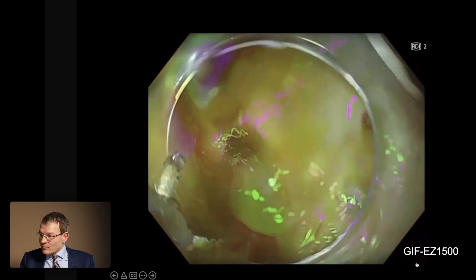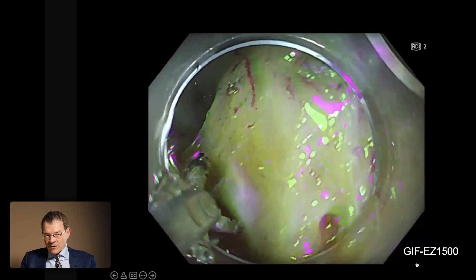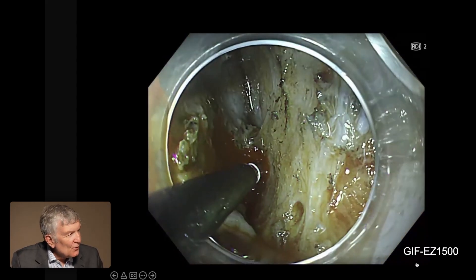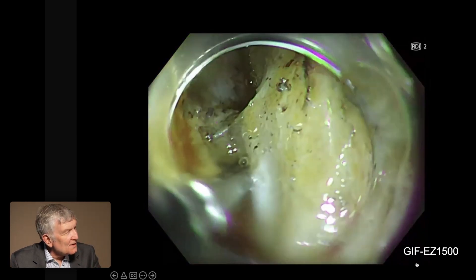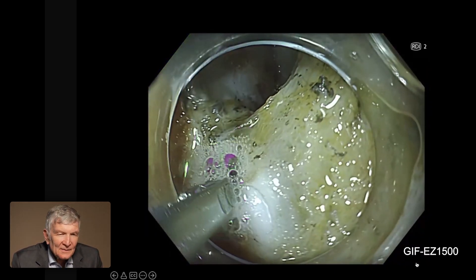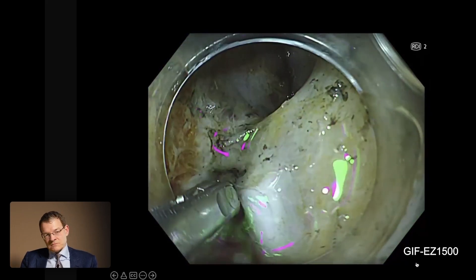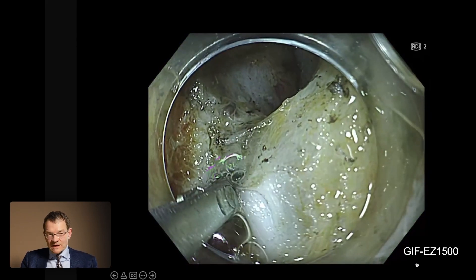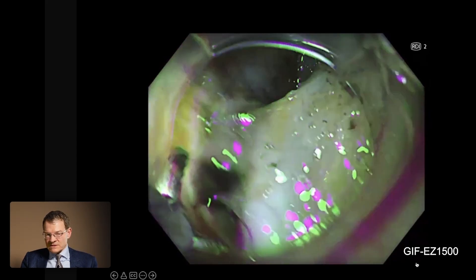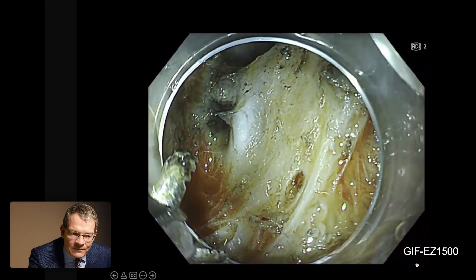A cap is also very important, and here we are now coagulating the vessel. You can compress the base with a cap exactly. So this is a nice example of relatively heavy bleeding during ESD, but in this situation we saved time and could better visualize the source of the bleeding.